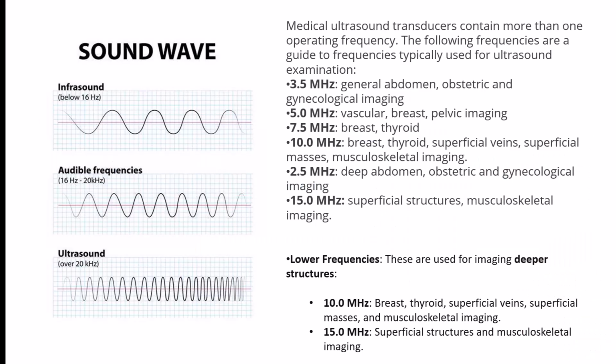Medical ultrasound probes or transducers contain more than one operating frequency. If we take a look at this list, we can see how the frequencies are used typically in an ultrasound examination for the different types of tissues or regions of interest that we want to display.